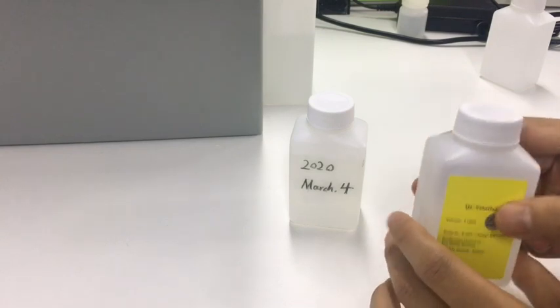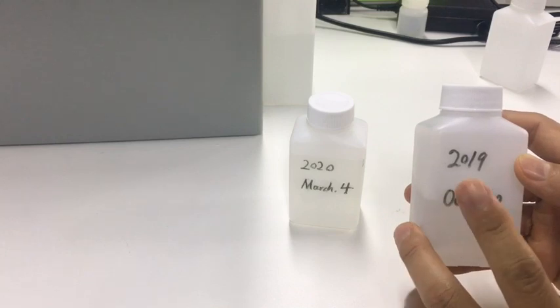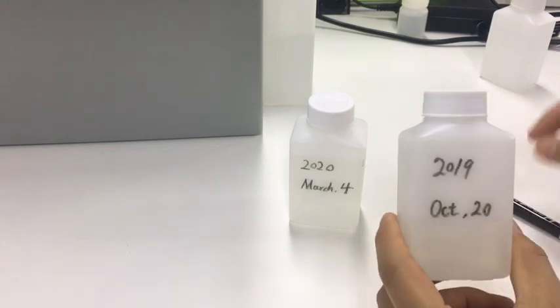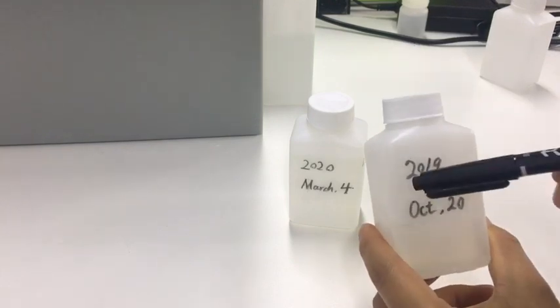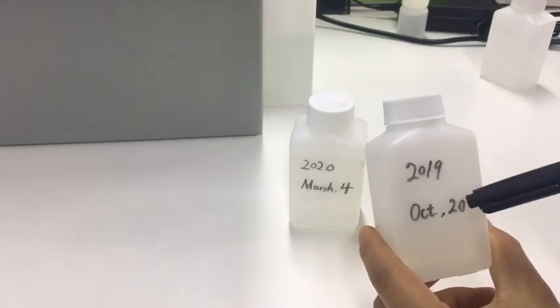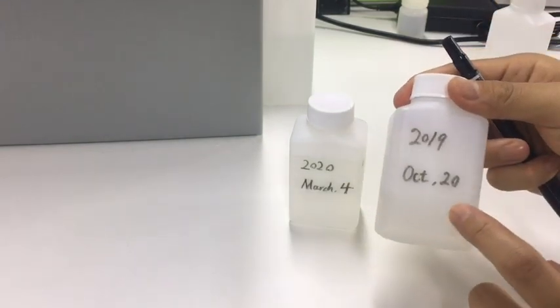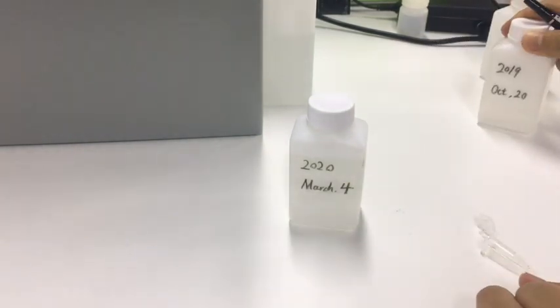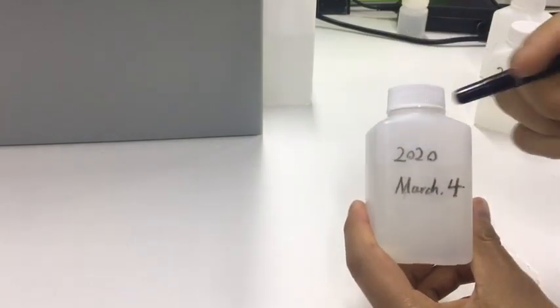But if it is opened, the warranty is one month. So we need to use a pen to note down the open date on the bottle, so it will be obvious for the end users. This one is already invalid, so let's take this one — this is what I opened today.